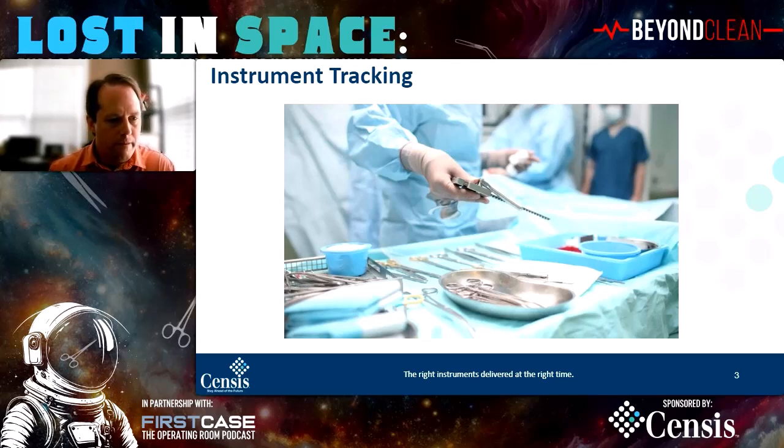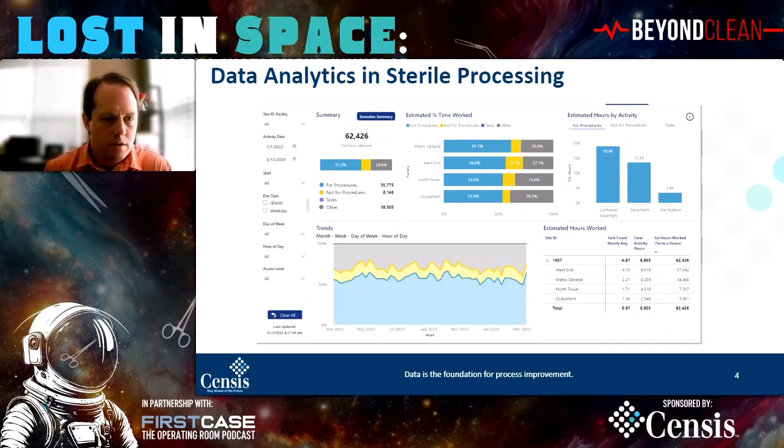So a little bit about instrument tracking systems and using that data for analytics. We had already had some success using data to produce analytics to help customers solve problems. Like I said, the first two problem sets that were top of everybody's mind were around staffing and productivity and quality of the trays. And it's not enough to just plot out, well, what did everybody do every day? How many issues have we had with trays?